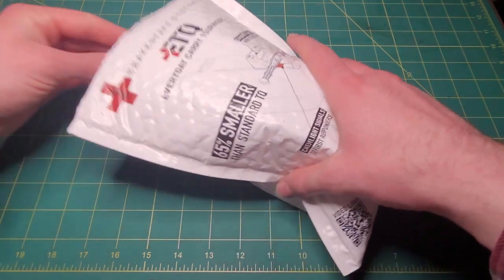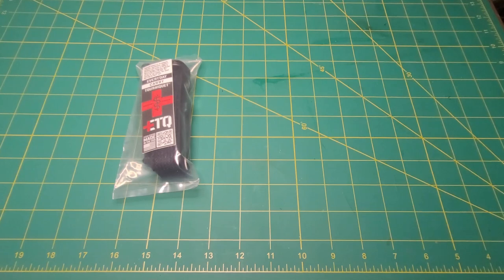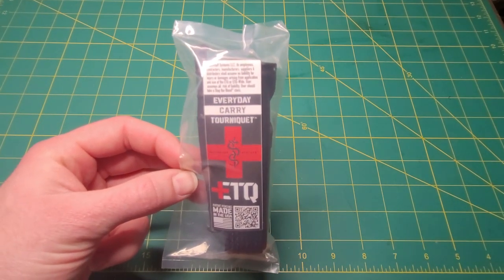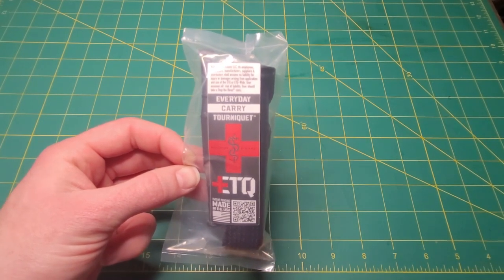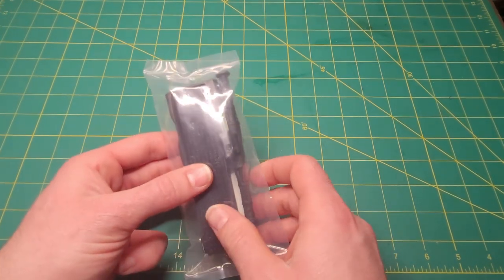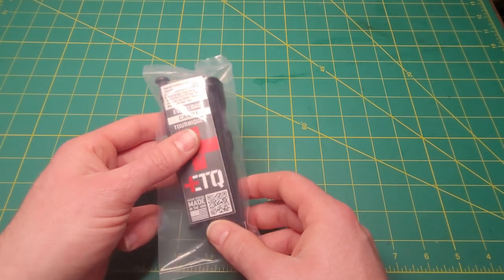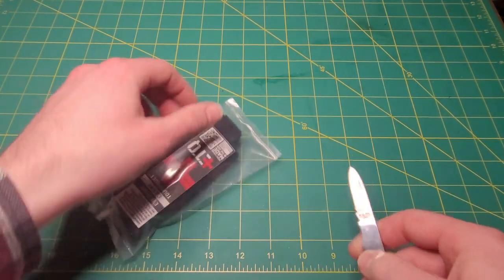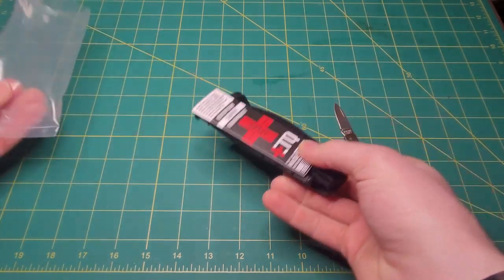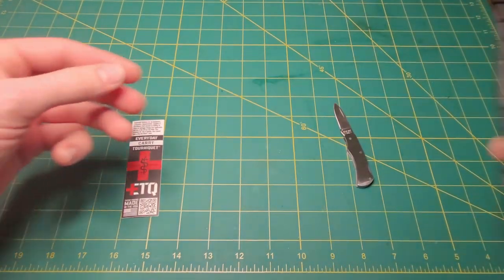When I ordered this a week ago, I was camping on their website right when the tourniquet dropped. I've been trying to get one of these for several months — it was just out of stock, out of stock. I'd miss the drop by a day or six to eight hours and they'd already be sold out. So I camped on their site, ordered it right when they dropped, and they had a shipping label to me within a couple hours. They got this to me very quick, which was exciting. Opening it up, it comes with a sticker — I'm a sticker guy, so that's cool.